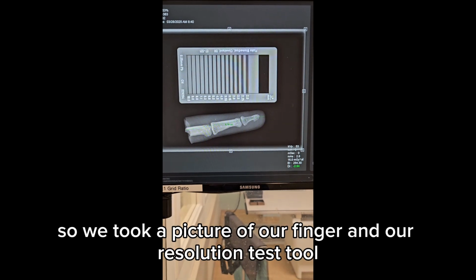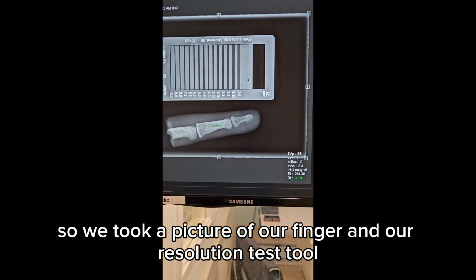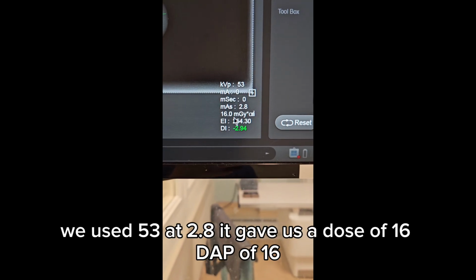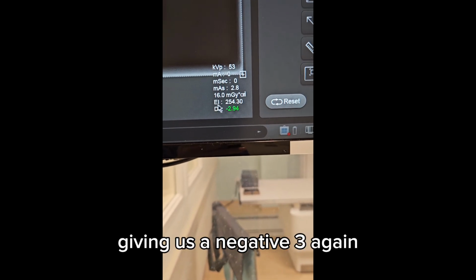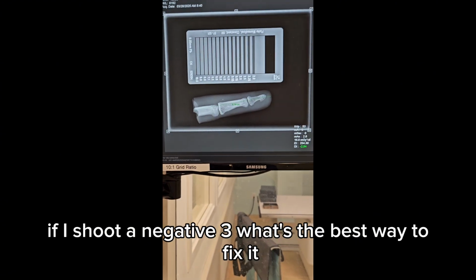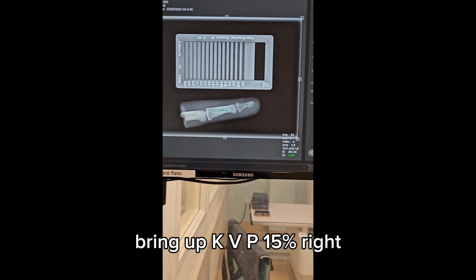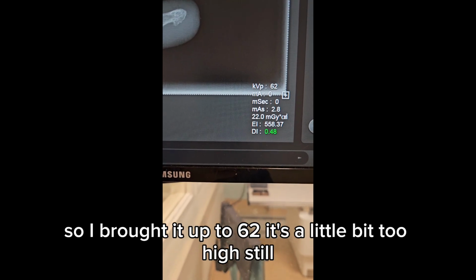All right, so we took a picture of our finger and our resolution test tool. We used 53 at 2.8. It gave us a dose of 16, DAP of 16. EI is 254, giving us a -3. Again, if I shoot a -3, what's the best way to fix it? Bring up KVP 15%, right? So I brought it up to 62.